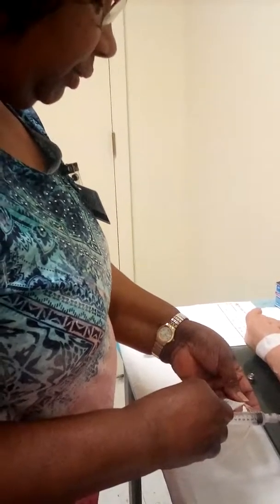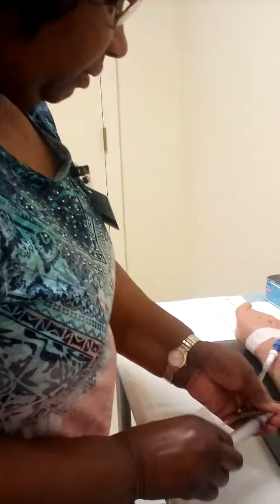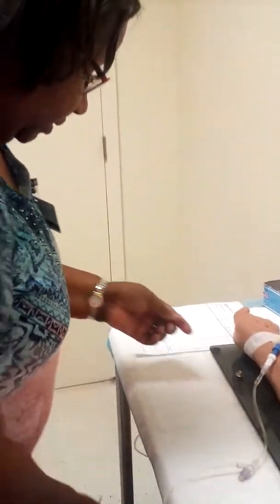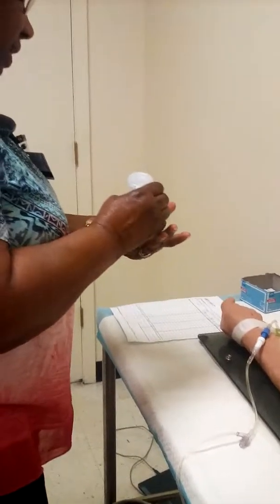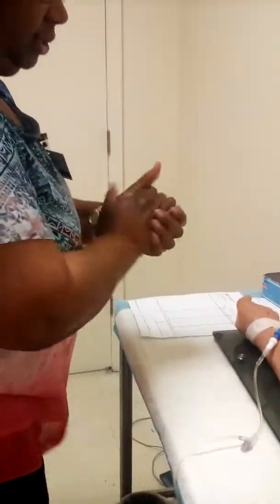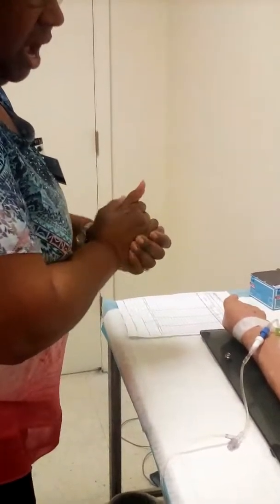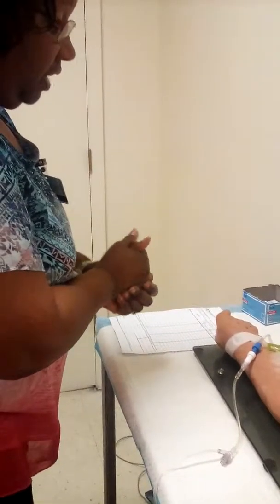Okay, I'm gonna push. Disconnect my syringe from my IV port. Discard my syringe. Wash my hands. Making sure that the patient is doing okay, in a comfortable position, and instructing the patient to call if they have any nausea, any vomiting, or blurred vision.